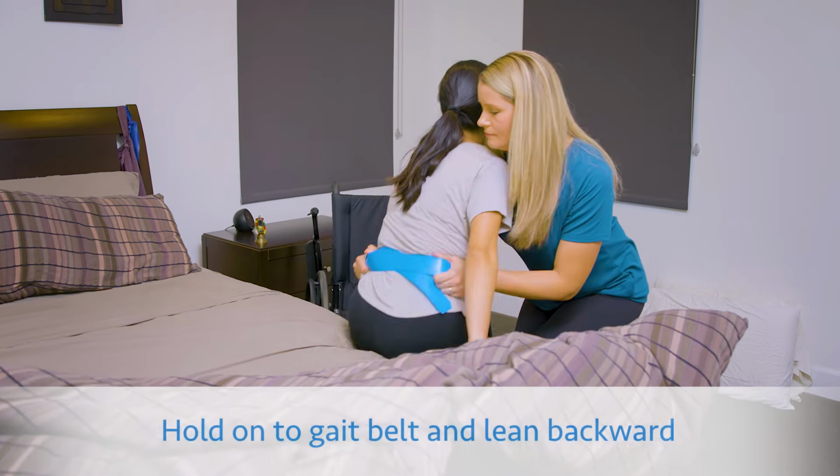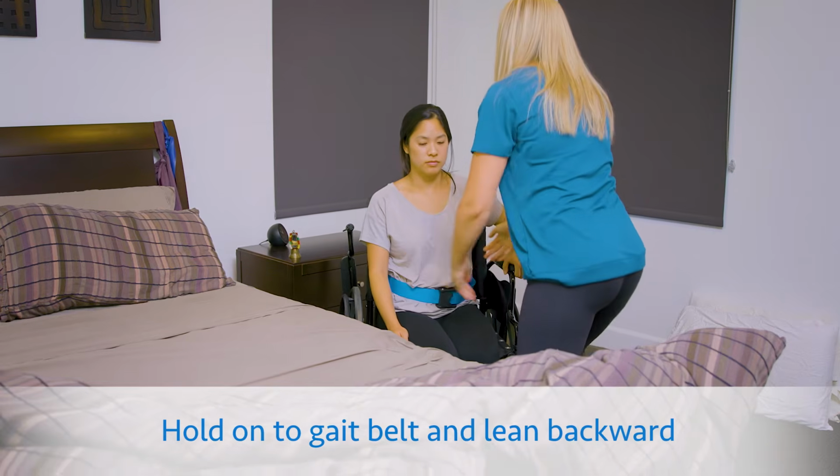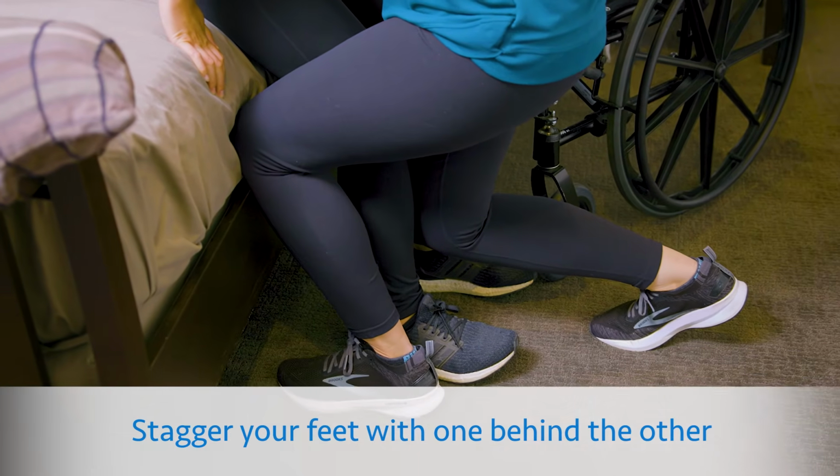As the patient leans forward, hold on to the gait belt and lean backward to leverage the patient up off the edge of the bed. Stagger your feet with one behind the other to receive the weight of the patient and maintain their own balance.